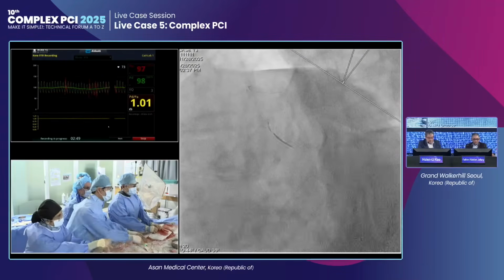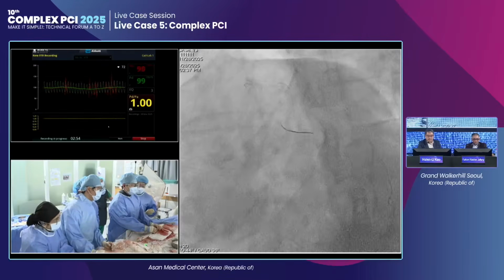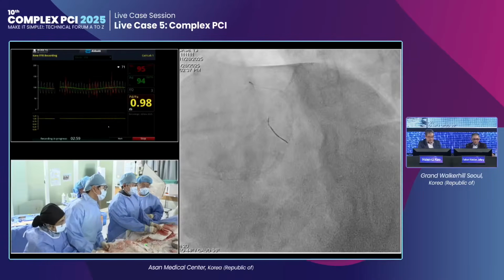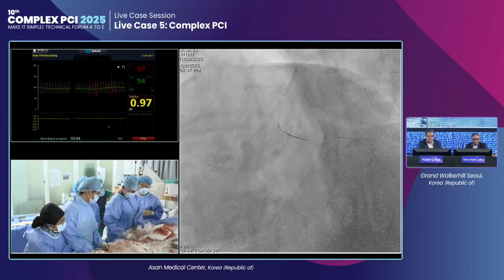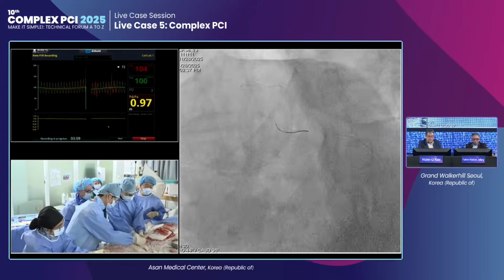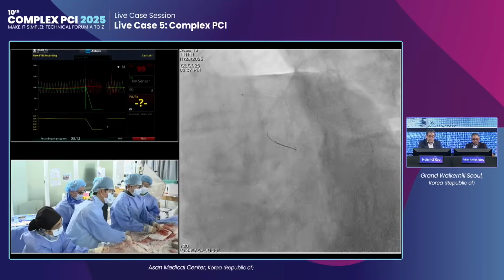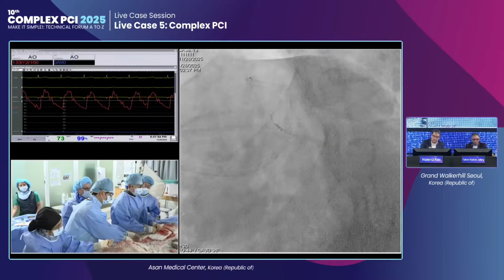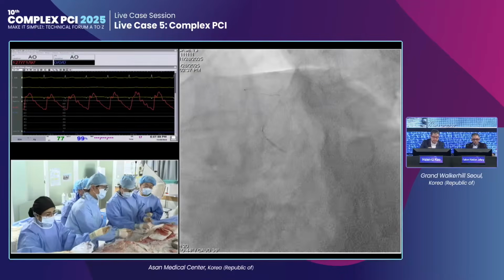That's negative. Okay, absolutely no change at all. Well, you got 0.97, I was right? For one. So that's pretty good.